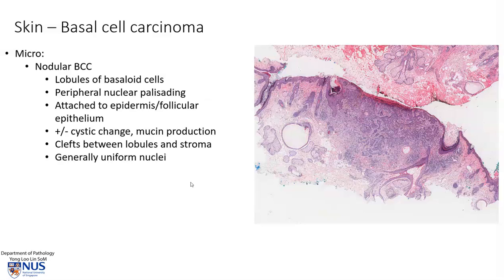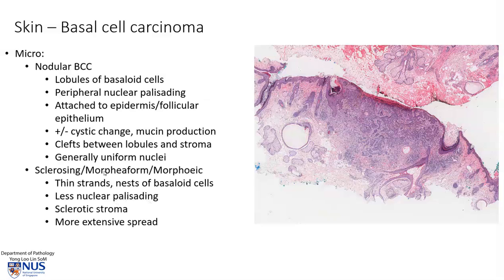I just want to mention one other subtype here: the sclerosing, also known as morpheaform or morphic basal cell carcinoma. This appears a little bit different. Instead of these rather thick, large islands or nests, we have thinner strands and smaller nests of basaloid cells with less nuclear palisading and much more sclerotic or fibrotic stroma.